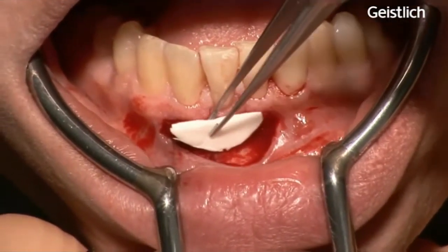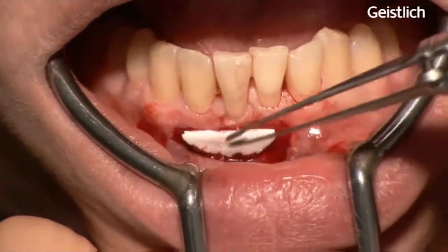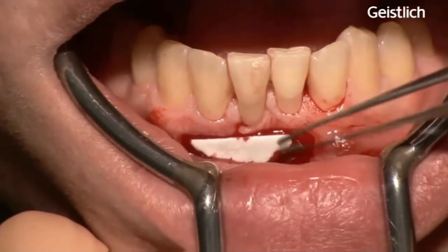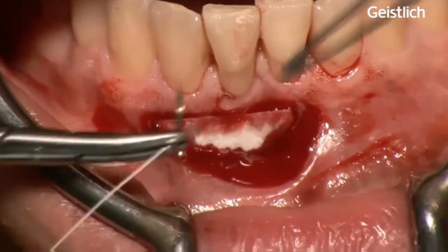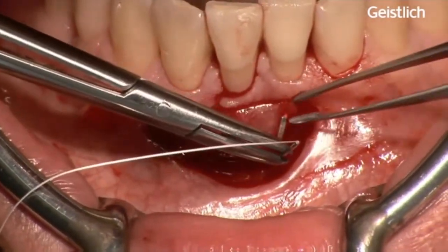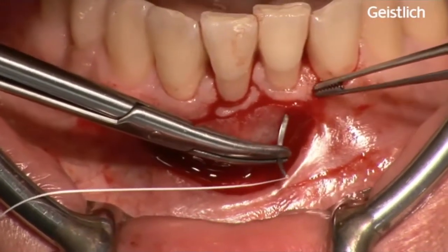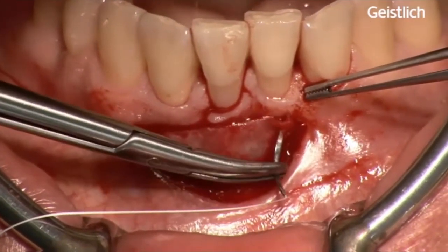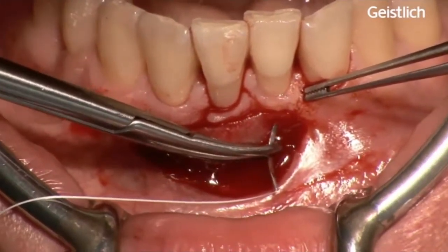Mucograft is placed on the prepared periosteal bed with the smooth surface facing the oral cavity and the porous surface facing bone and periosteum. The matrix is fixed to the small coronal band of keratinized tissue and to the periosteum and, if necessary, to the surrounding soft tissues with non-resorbable, non-irritating 6-0 interrupted sutures. Complete penetration of the matrix by blood and exudates allows perfect adhesion of the device.